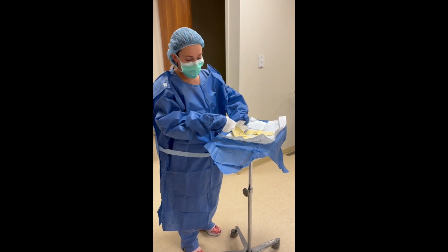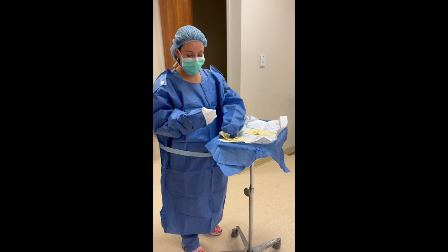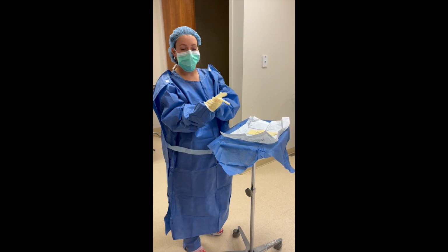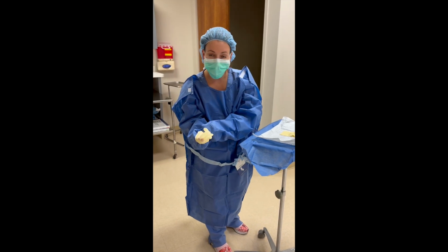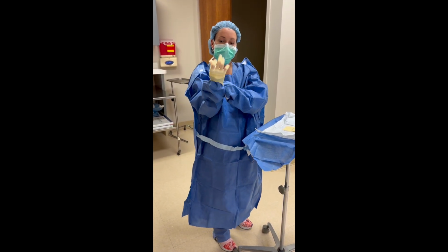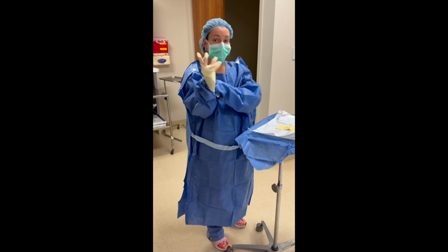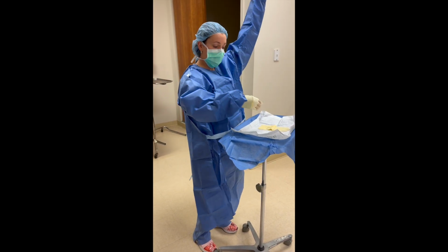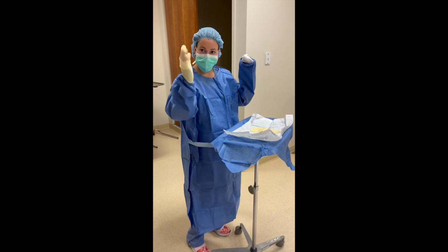So I pinch the inside of the right glove that I want to put on my right hand. I put the cuff in there. I hold it right there. I get my fingers kind of worked out of the cuff so I'm not fighting with it. And then I pull it down to the best of my ability. I don't pull it till it's all the way perfect. It's not going to be. So it's going to look like this. And then I'm going to use this hand, get it ready to rock and roll, and come back and adjust this hand.